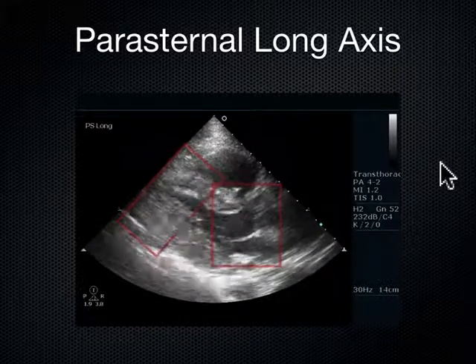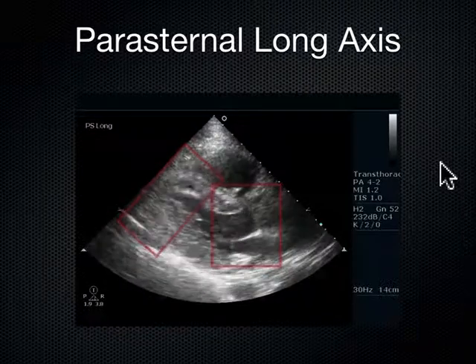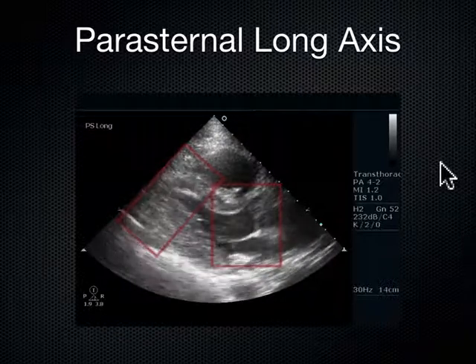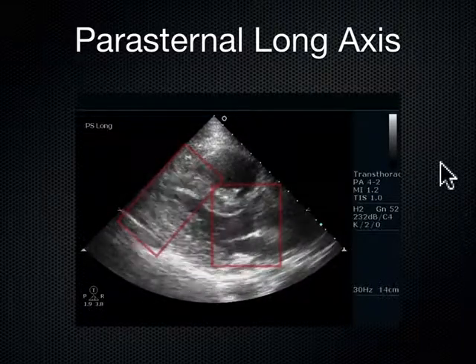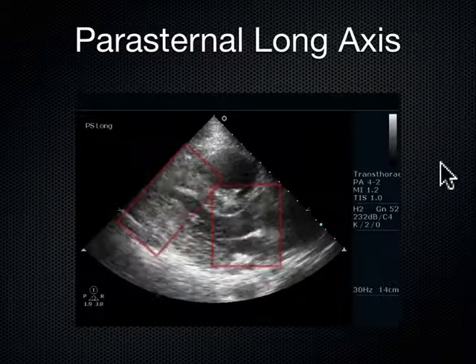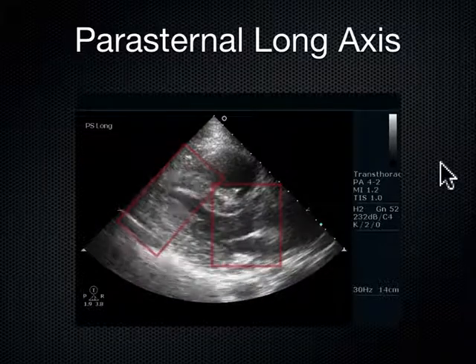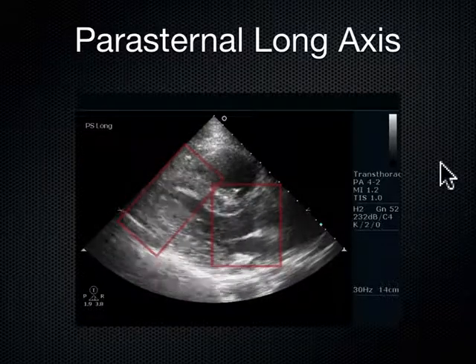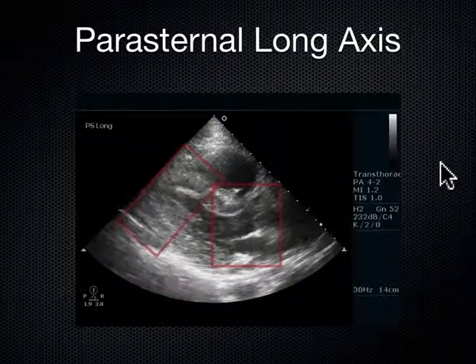Yeah, would the ratio change depending on the cross-section that you're taking, or potentially maybe the angles? So that's a good question. So how do we know that this is really, I mean, we've got this long axis through the heart. If I fan the sound from one side to the other side through this cylinderish, cone-ish thing, maybe I'm just shortening my axis, my view of it, right?